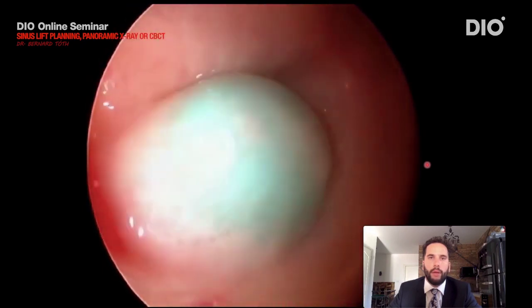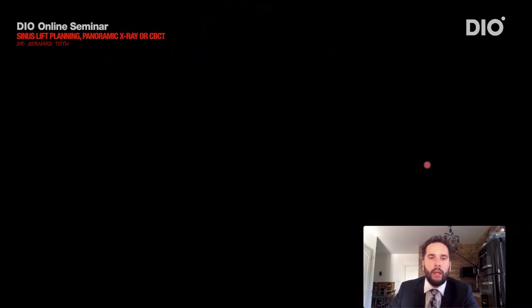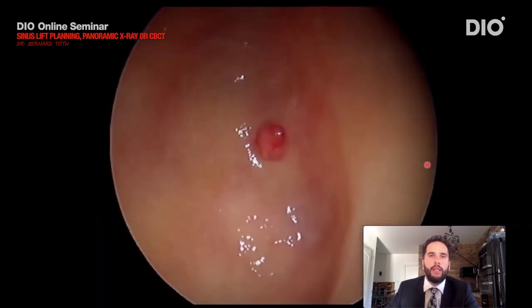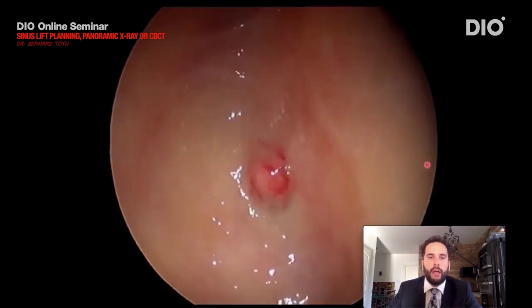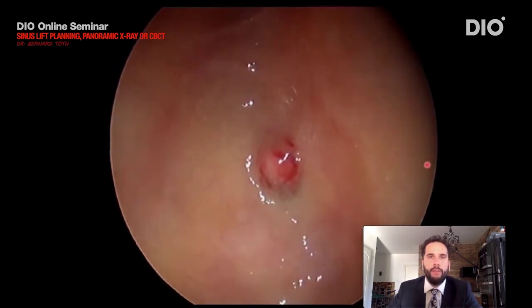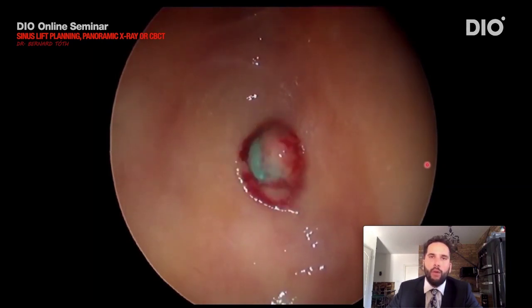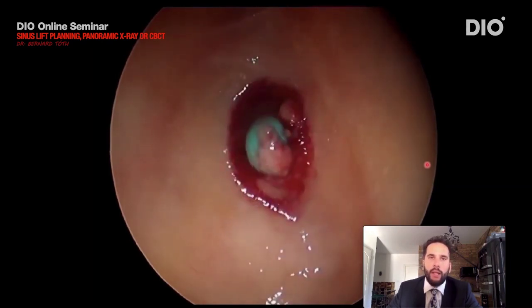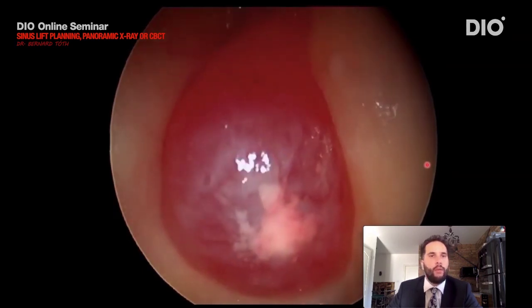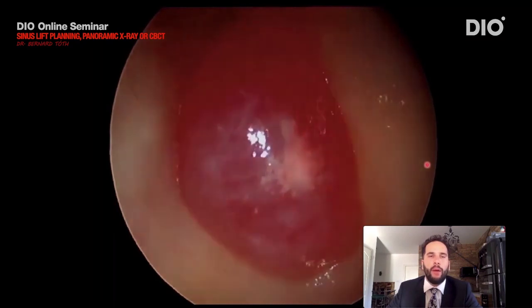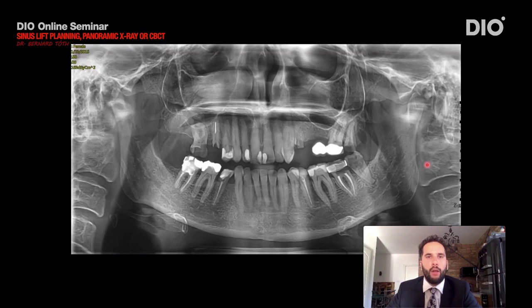This video was actually an accident — after short use of the balloon it perforated. But it shows well that it is enough to use the balloon to overstep the critical tightness and keep the elevation concentric. After that, as you can see, the water is able to elevate the membrane further and we can have a pretty nice elevation.